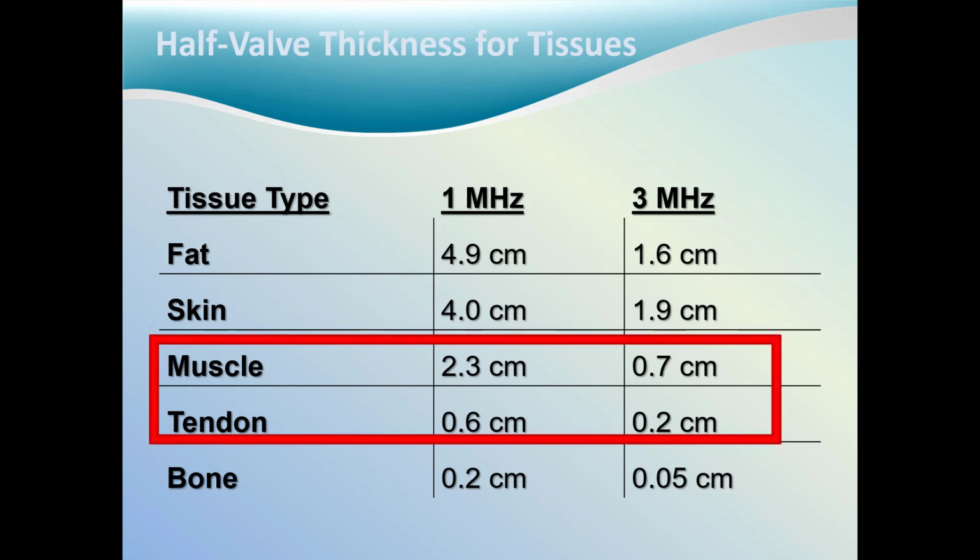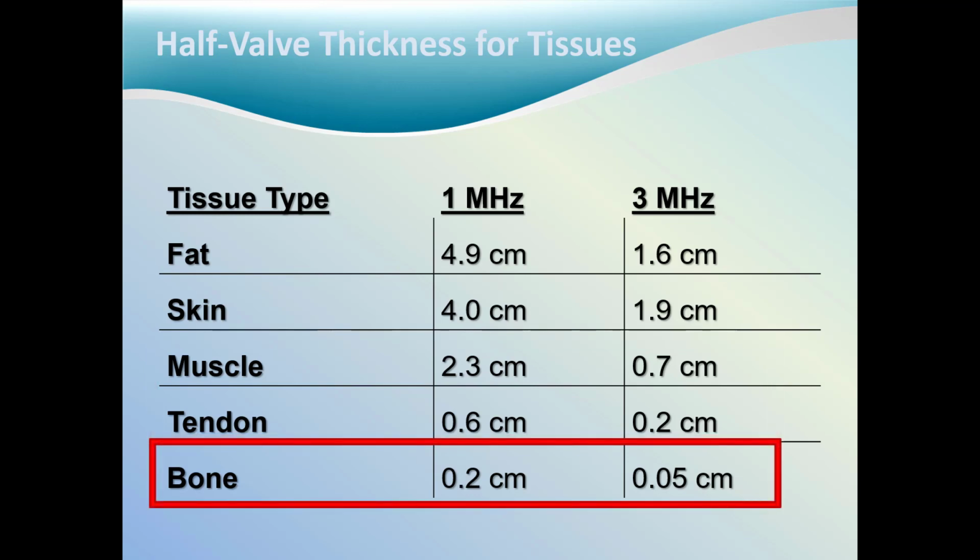Muscle tissue easily absorbs energy, as do tendons or other high protein or collagen content. Although not shown on this graph, peripheral nerves allow energy to be absorbed at twice the rate of muscle. And finally, superficial bone, the energy is absorbed more efficiently than any other tissue.